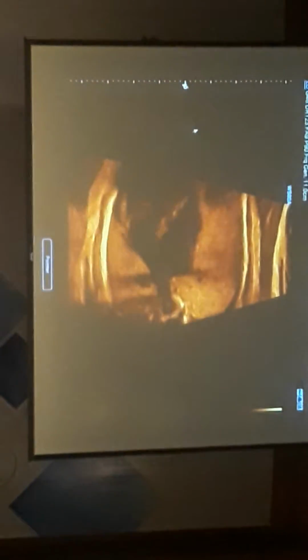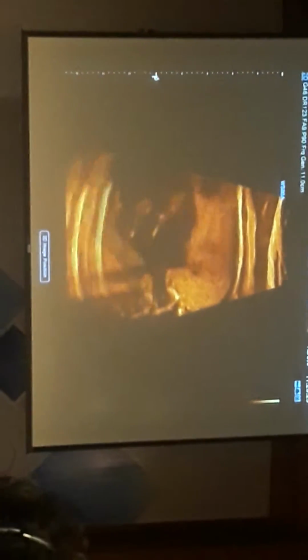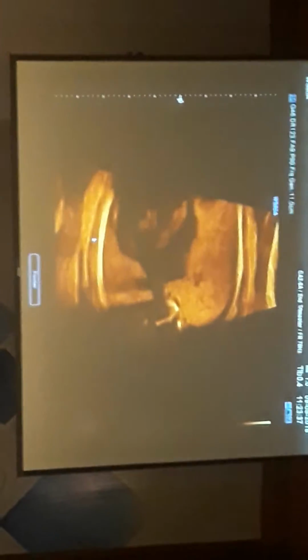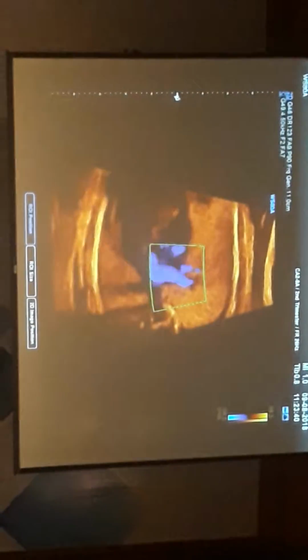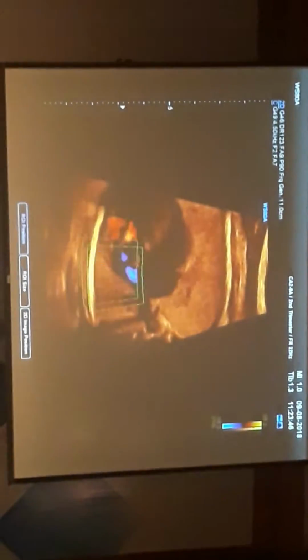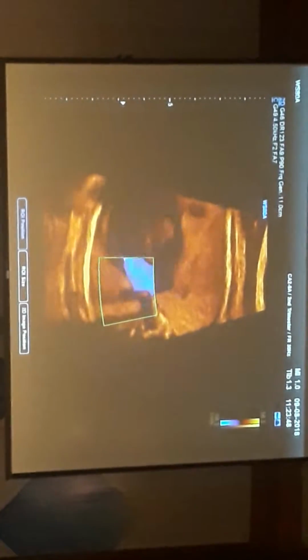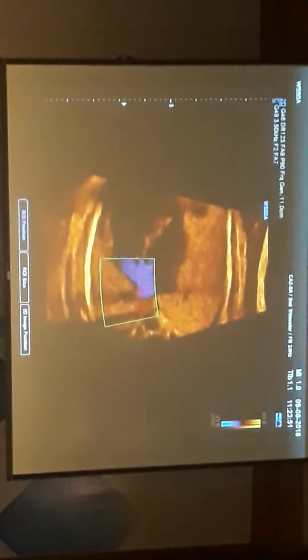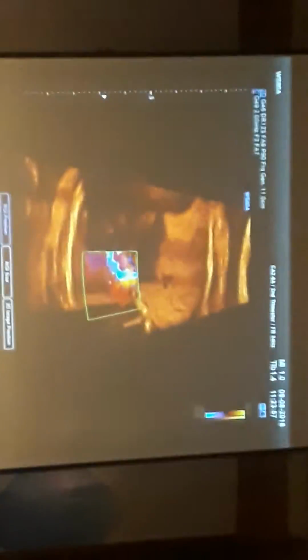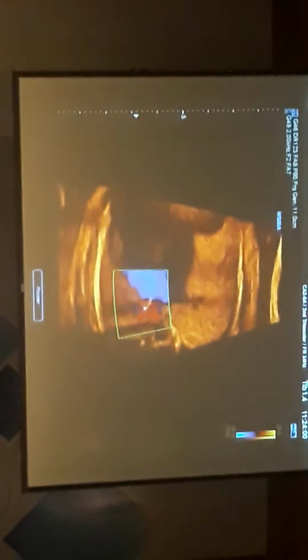Now, segmentally speaking, what are we seeing? I think I'm seeing pulmonary veins, perhaps. So let's put color on and see if we can see that. Yeah. Looks like a couple veins up here, and a couple from here. So they look to me so far like the pulmonary veins are normal.